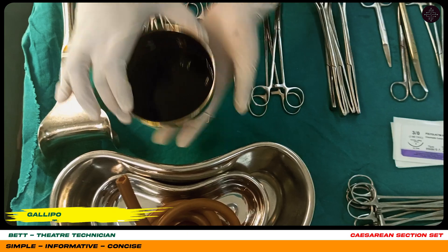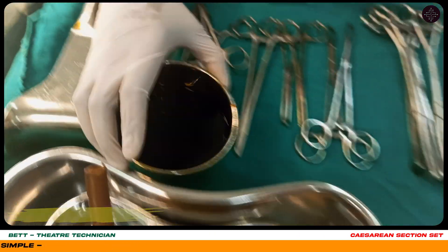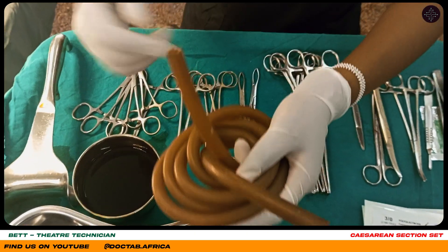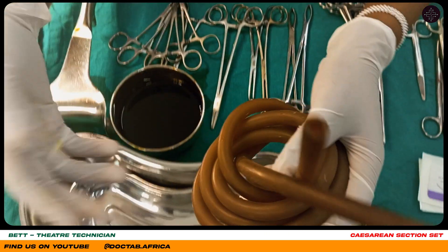This is a gallipot. We use it for holding fluids when cleaning. This is a suction tube. We connect it to the suction to suction fluids — blood and other fluids.